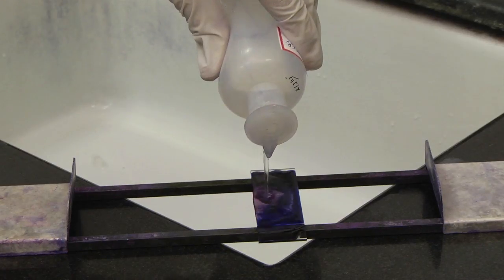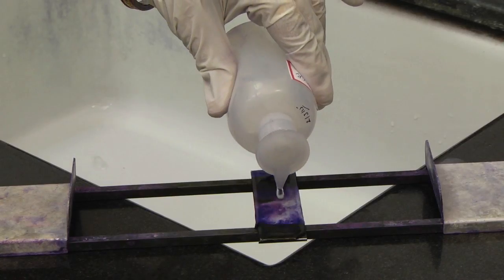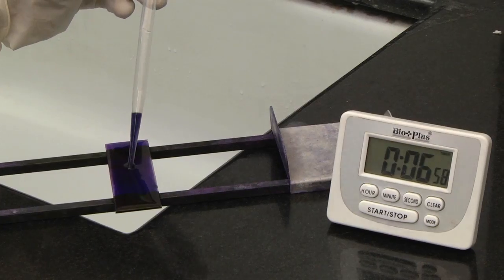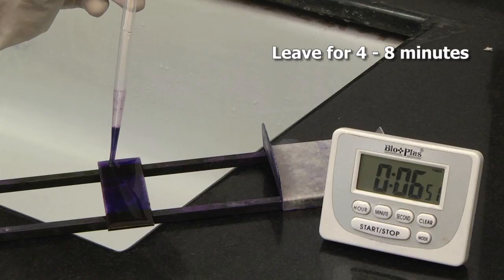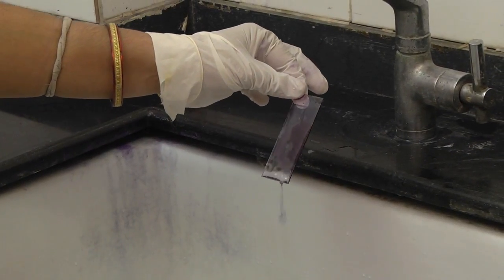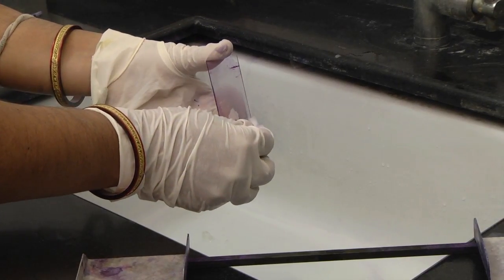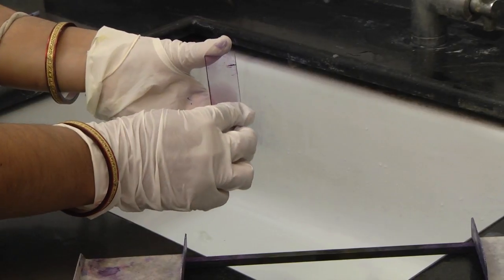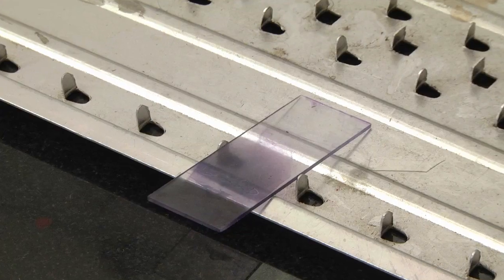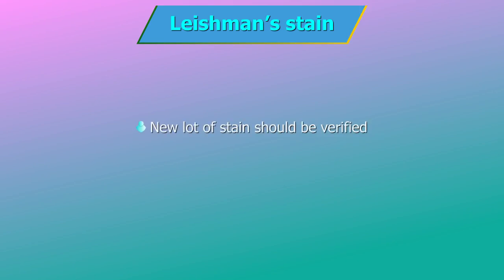Then add 12–15 drops of buffered distilled water using a disposable dropper. Mix thoroughly. Leave for 4–8 minutes. Then wash off with clean water. Wipe the back of the slide with clean cotton to prevent stain deposits which can hamper the reading of the slide.